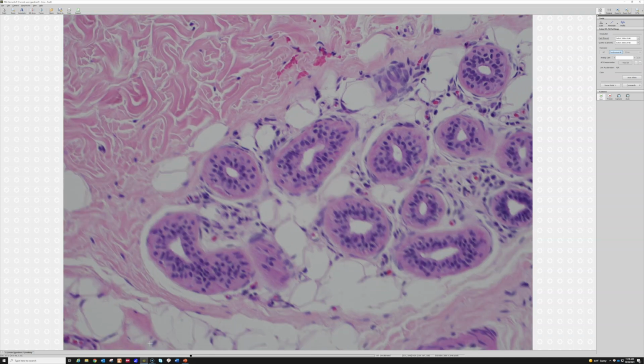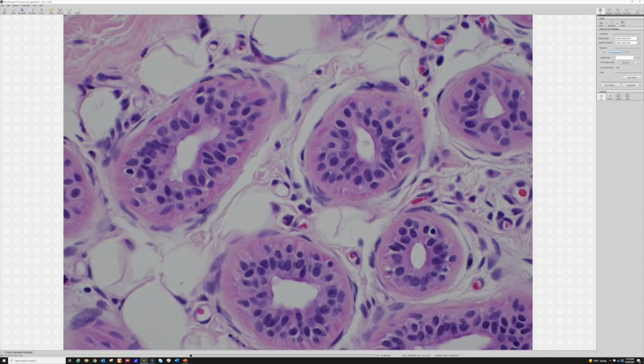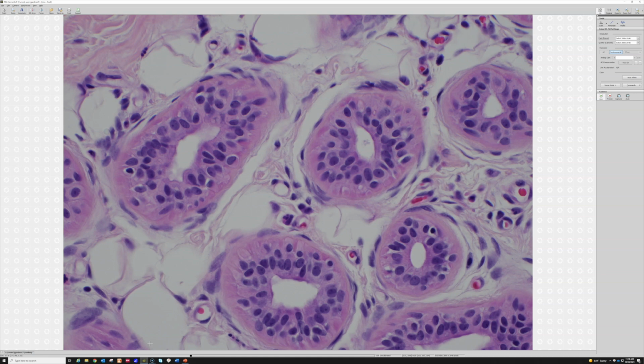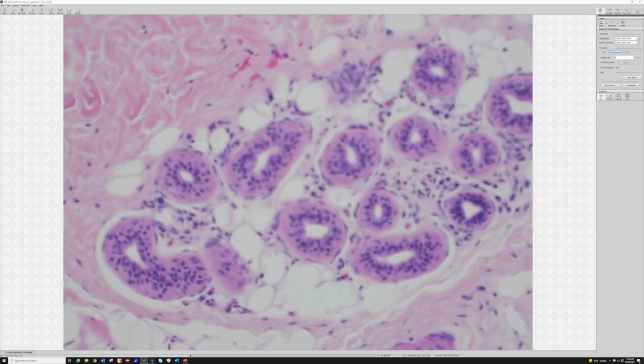And then again, looking closer over here for comparison, eccrine glands. The cells are much smaller. They are not as perfectly round. The cytoplasm is not as bright eosinophilic, pink color, and you don't have those big, large nucleoli. You might have some little tiny nucleoli, but they do look quite different, okay?